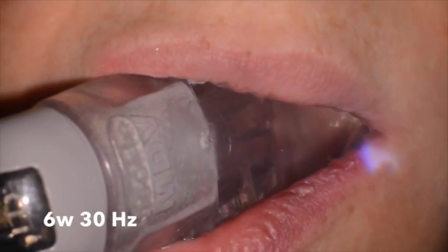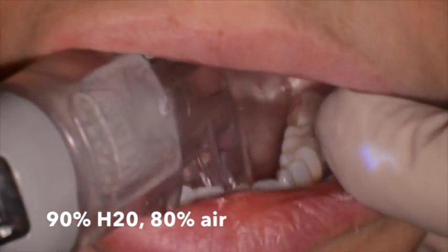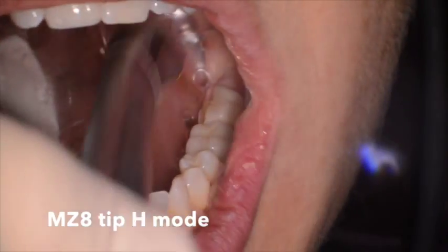We're using the I-plus laser here with the patient using an isolite at 6 watts and 30 hertz, 90% water, 80% air, and an MZ tip in H mode.